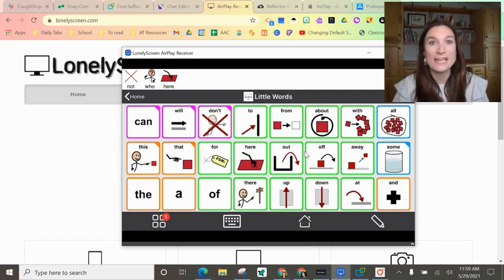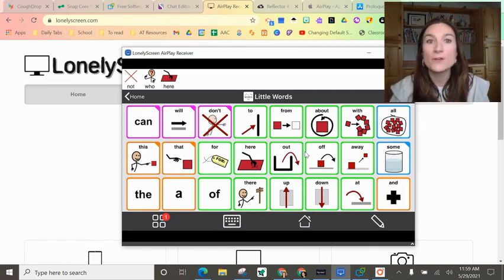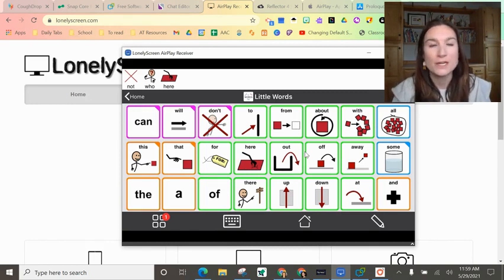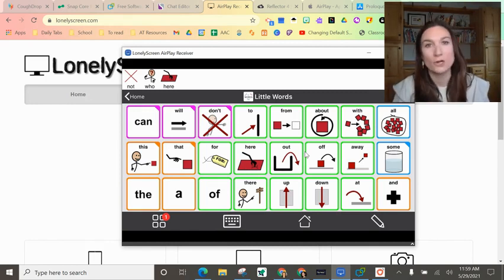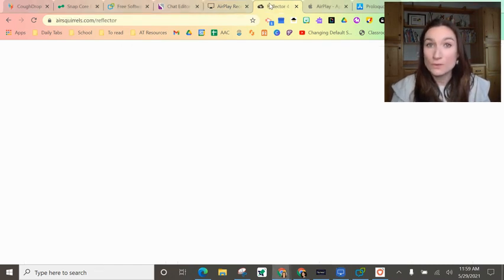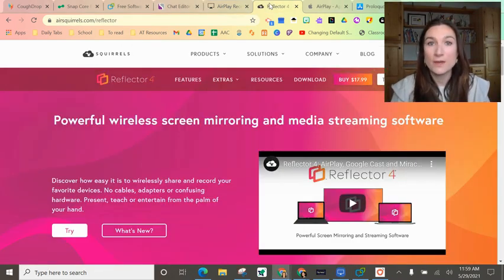So this would be for any app like Speak for Yourself. I haven't found another option - I would just be mirroring my iPad. If you don't want to use Lonely Screen, here are some other options.